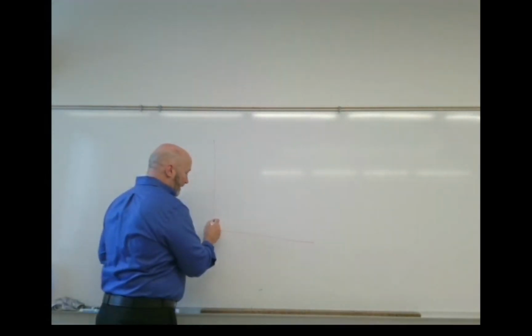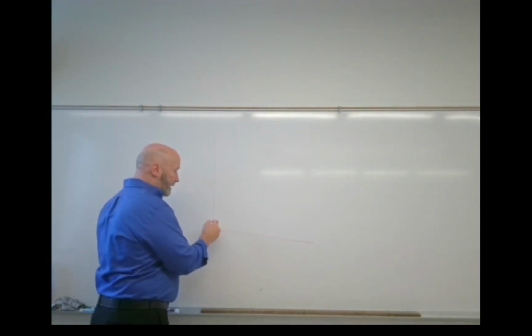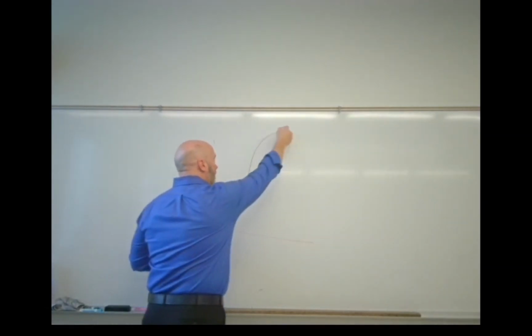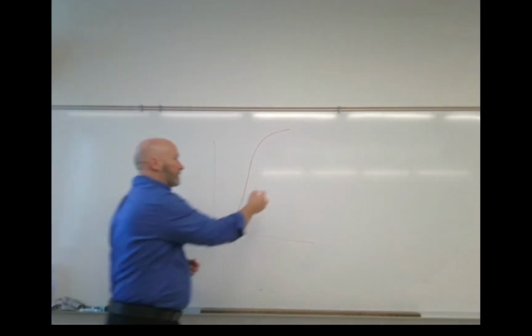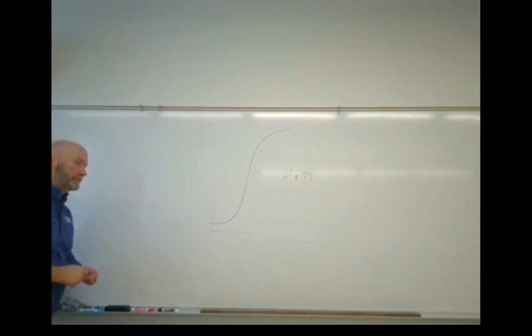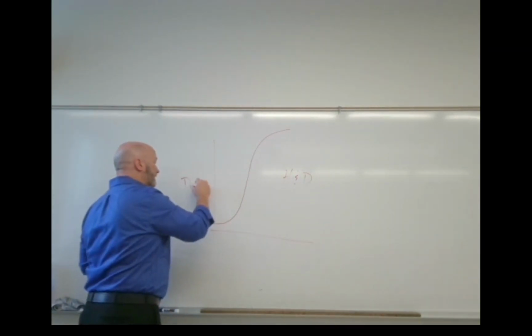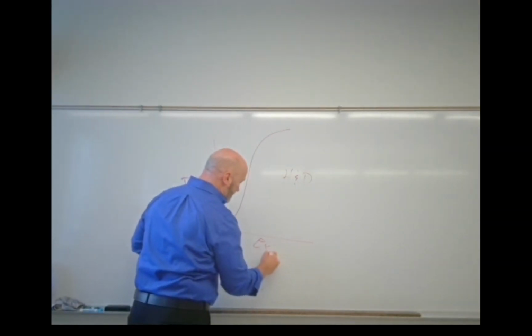So what we get then is on our H&D curve, once we plot all those different densities, we measure the light that's coming through the film, and what we would get is a curve that looked like that. Again, this is the H&D curve, Hurter and Driffield, the sensitometric curve, or D log E curve, and the reason it's the D log E curve is this is the density axis, and this is the exposure axis.